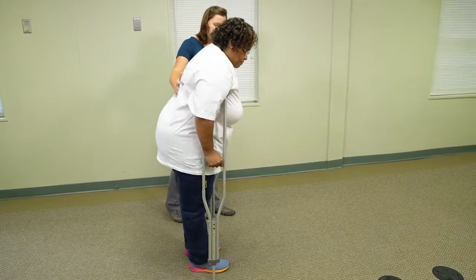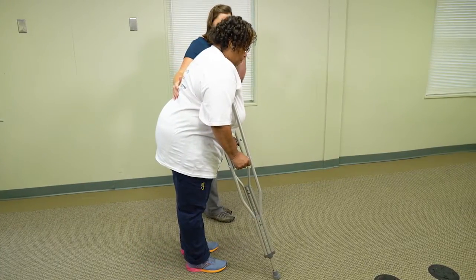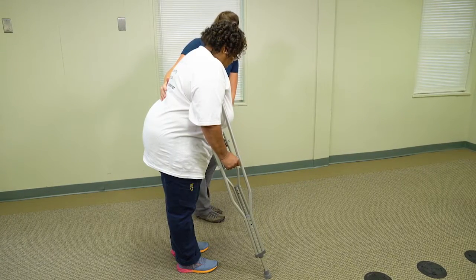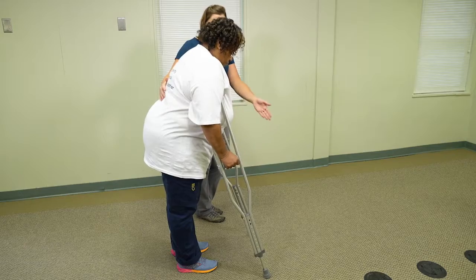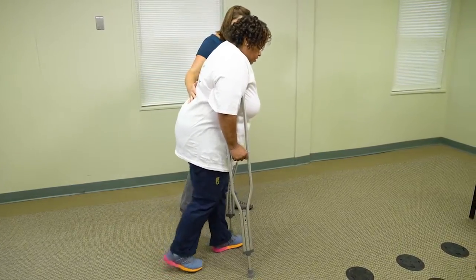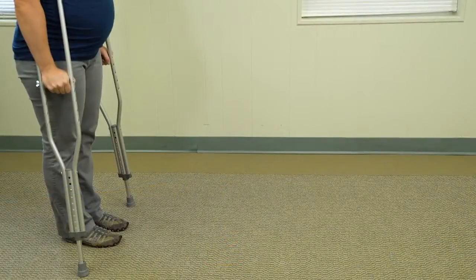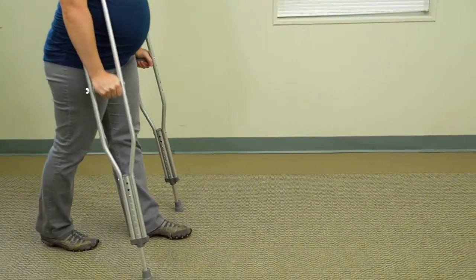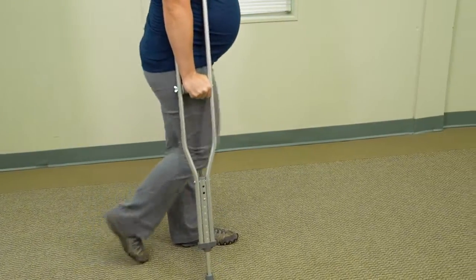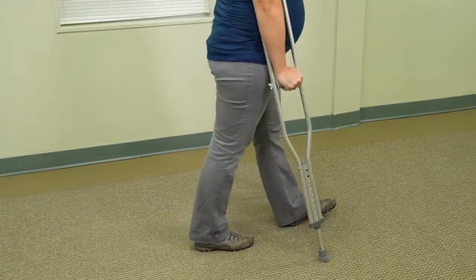Good, push through. Perfect. Now as you start to get more comfortable with that, you can move the crutches and your affected leg together, and you can step through with your unaffected leg. I'm going to do this one more time. You move the crutches and your affected leg together, and then step all the way through with your unaffected leg. So crutches, affected leg, and then stepping all the way through. You're still pushing through your arms each time you take a step with your affected leg.